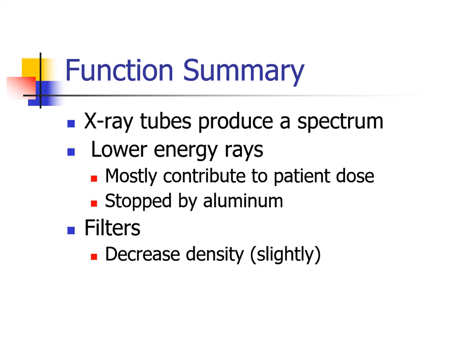The addition of a filter will decrease density slightly. Some of the higher energy rays will interact with the filter material and be stopped before reaching the image receptor. Adding a filter theoretically increases contrast slightly by reducing fog production. This will increase contrast resolution in digital radiography systems.